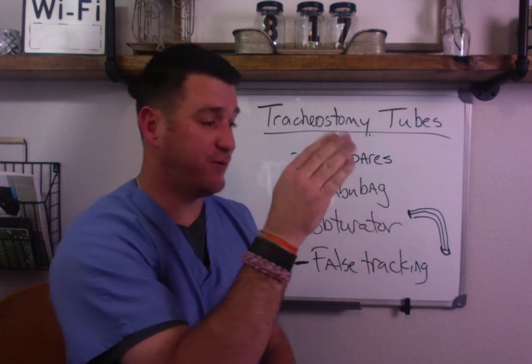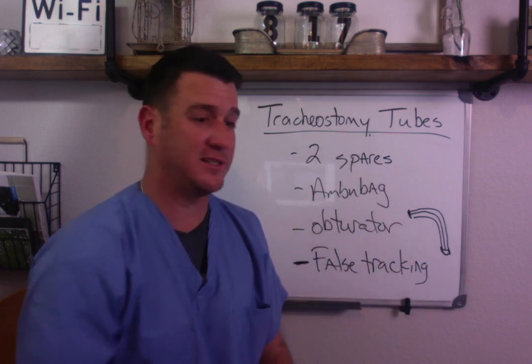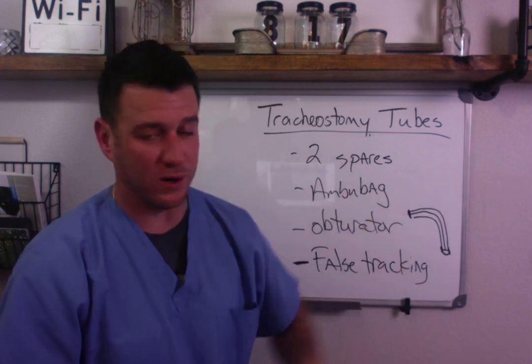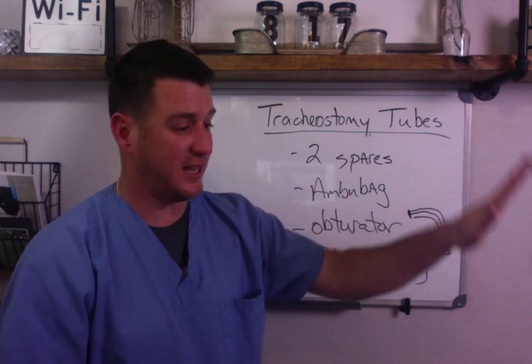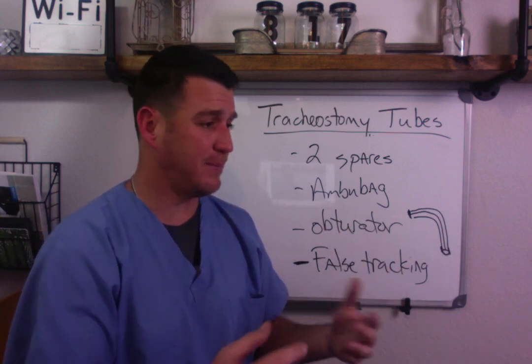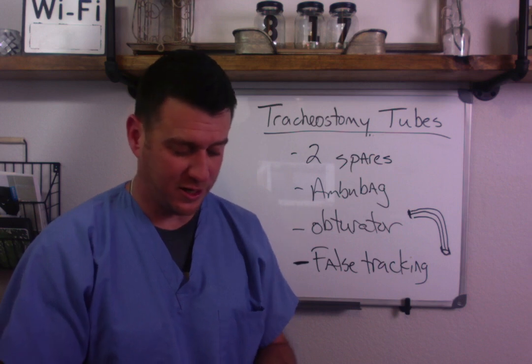Okay? If you're in the airway, you will achieve that end-tidal CO2 return and you'll go, this is what I was hoping for. My airway is in an appropriate place. My patient assessment following the replacement of the trach tube, everything looks good. And my patient tolerated the trach change out correctly.